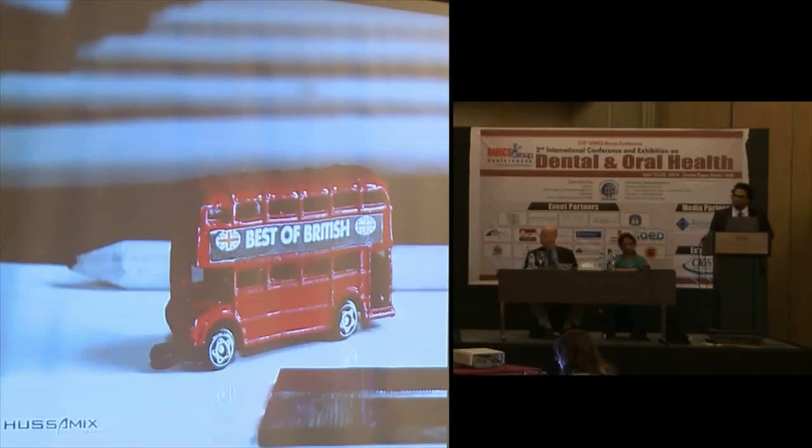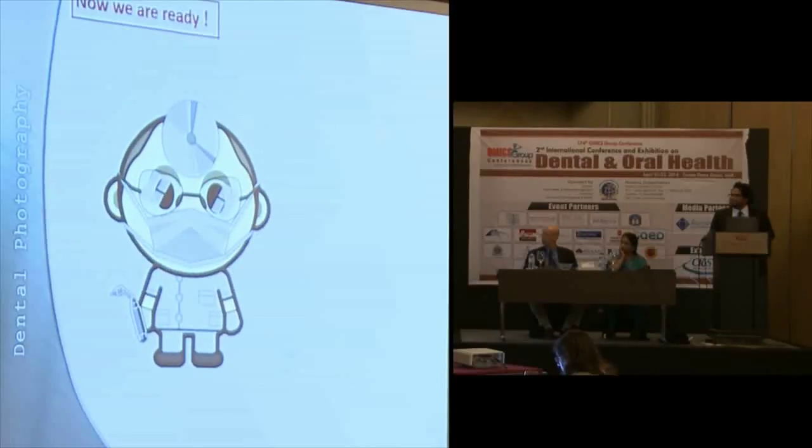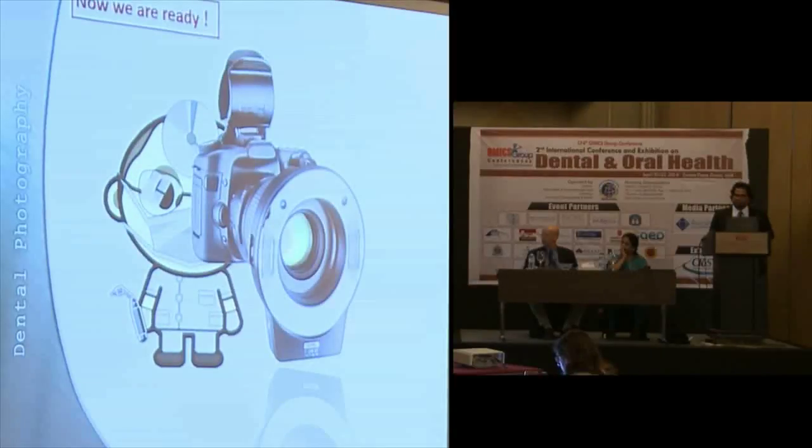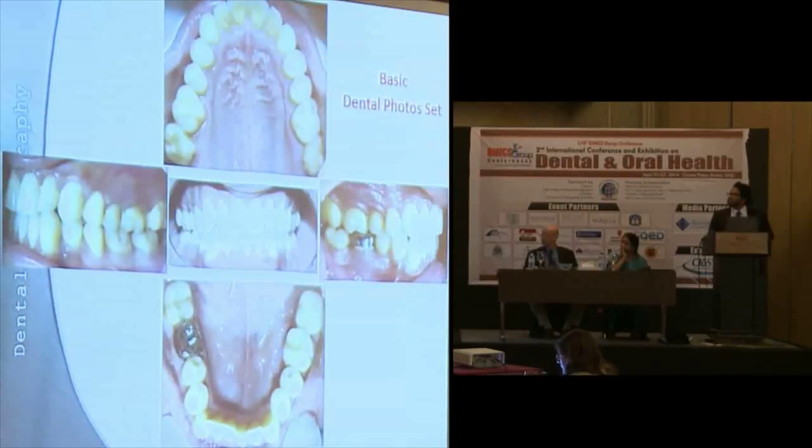That was taken using a macro lens. Okay, now we are ready, and that's our dentist well prepared for taking the photos. That's the basic dental photo set that we will go through picture by picture.